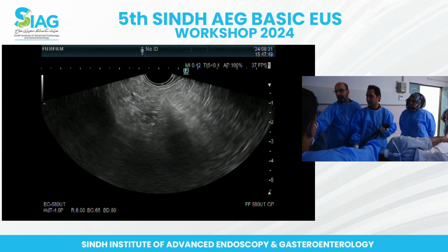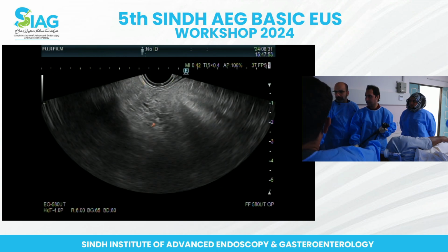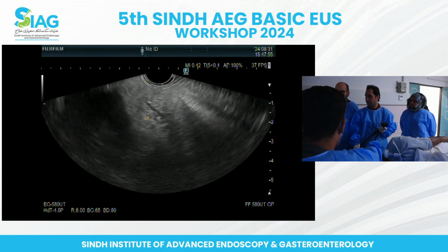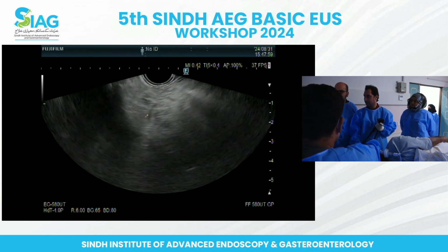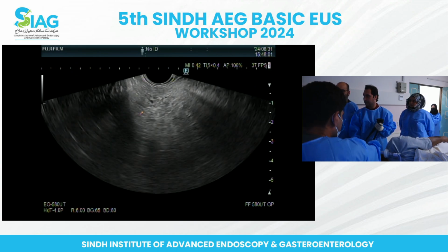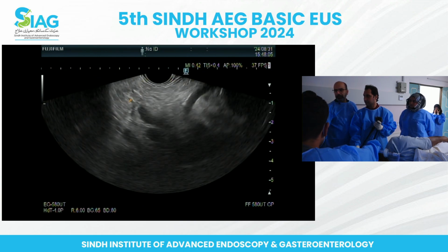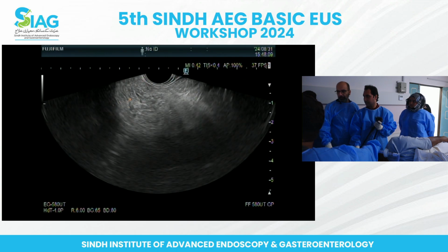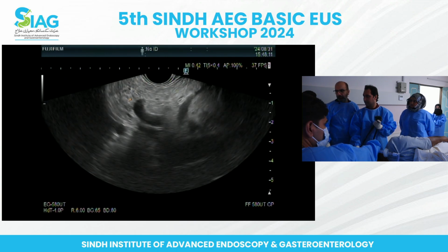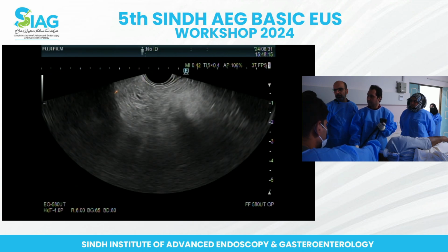So if you go forward a tiny bit and go counterclockwise, keep going counterclockwise. Big wheel slightly towards you and go counter, and you'll start following the pancreatic duct towards the tail. So keep going counter. Keep dropping that left hand and relax the big wheel because it's going away from you, right?